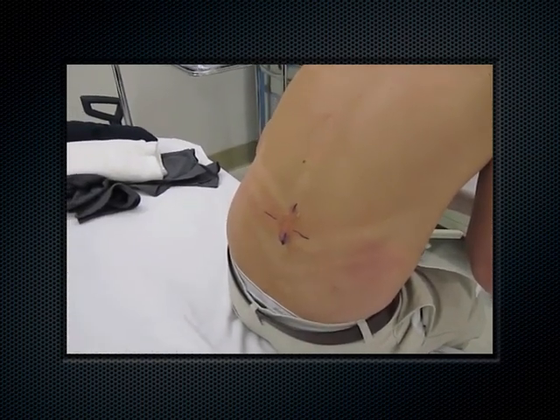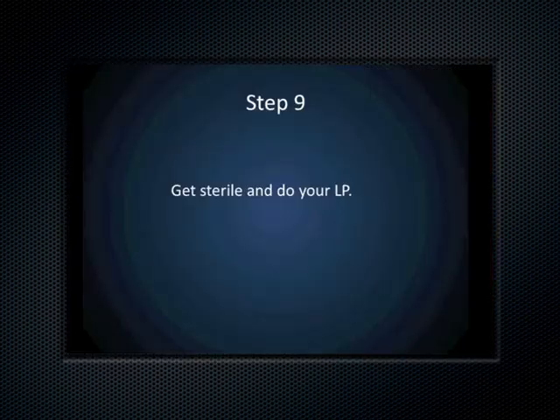at the intervertebral space. You may find that your hash marks may be removed when you sterilize the patient's back. So before you actually apply betadine to the patient's back, use a pen or a needle cap to make a skin impression. Now you are ready to do your LP.